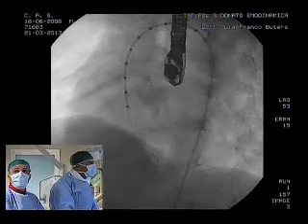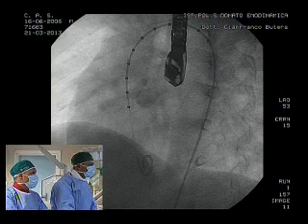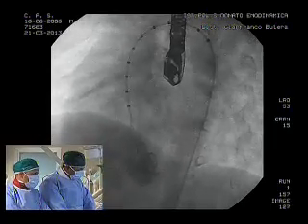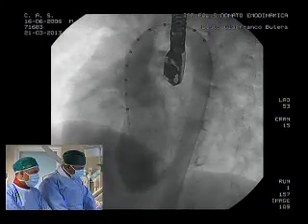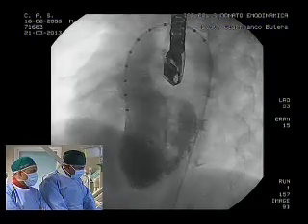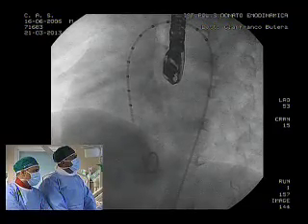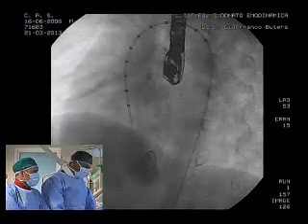Hi. I just want to raise the unpopular position at this meeting that I might not do an interventional procedure on this patient. And tell me why. Because even if you pull this into the pouch, I think it's going to be very hard for me to envision, from the pictures that Aki showed, that some portion of the device is not going to sit on the undersurface of the aortic cusp, the aortic valve. Even though I think it'll look great today, I'm a little worried about taking somebody who has such benign hemodynamics and doing something that might ultimately, 10 years from now, cause them to need an aortic valve replacement. So I just wanted to throw that out.